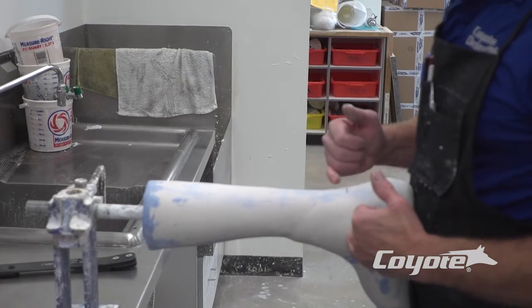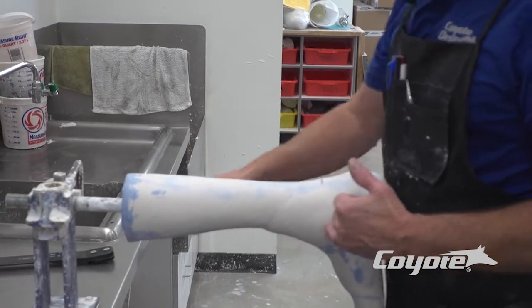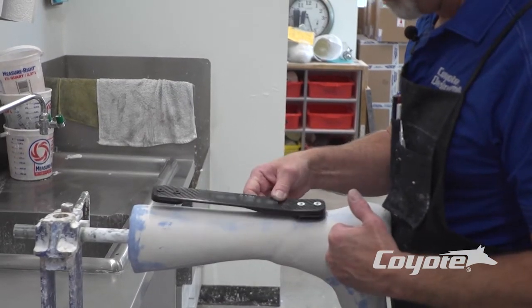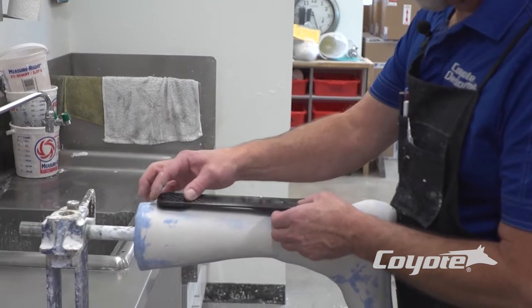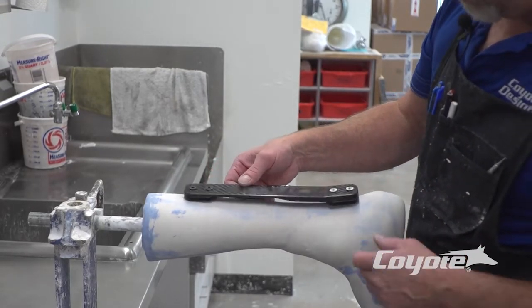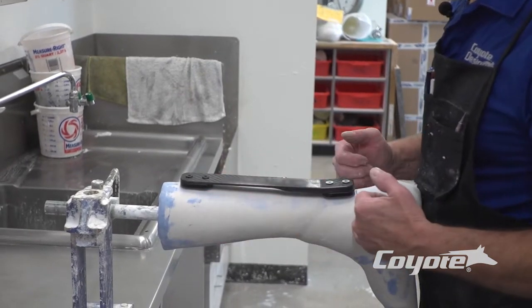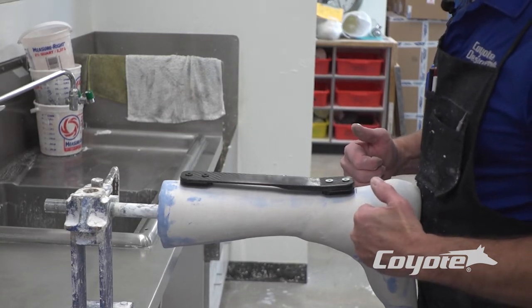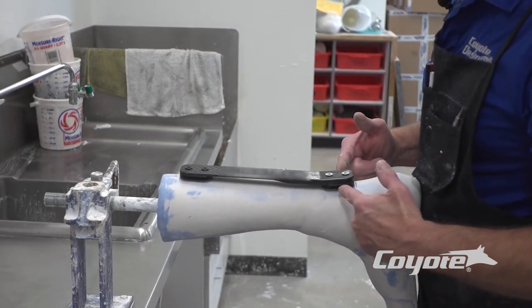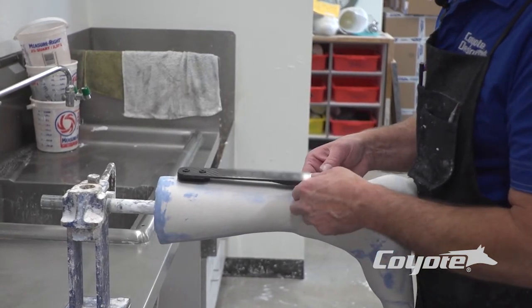You could go higher if you need to, but if you go lower it becomes a shoe fit issue and you start riding into areas on the back of the heel that you don't need. Looking at him at this midline mark between our two ankles, that looks really good. Our calf section isn't too high and we're not so low that we're back into the Achilles and heel. The optimum place for the strut to work correctly is taking that medial and lateral ankle and splitting the difference — which tends to be about dead center of the medial, sometimes a little proximal to the lateral — and that four-inch mark looks really good.